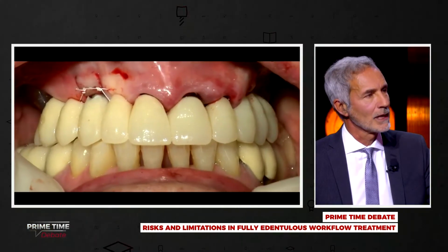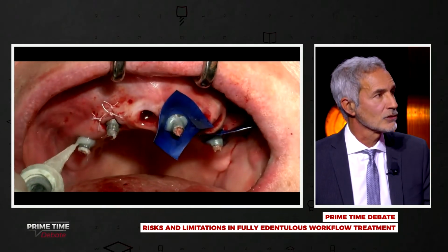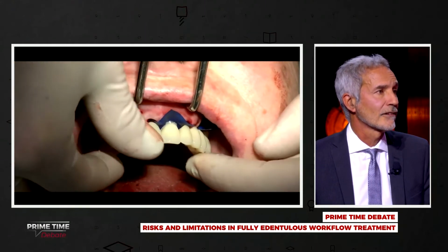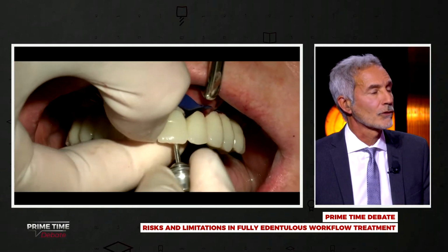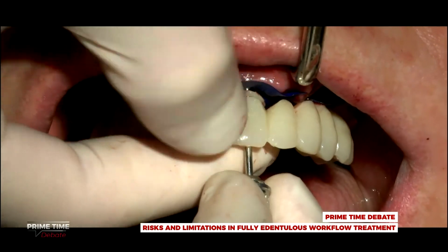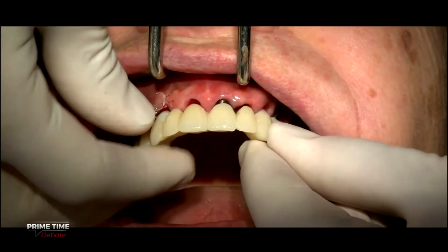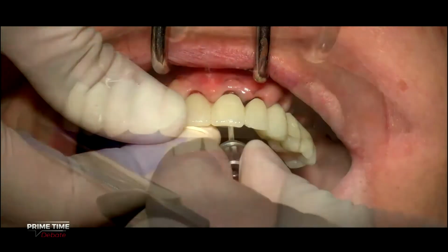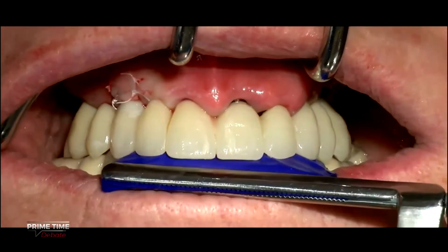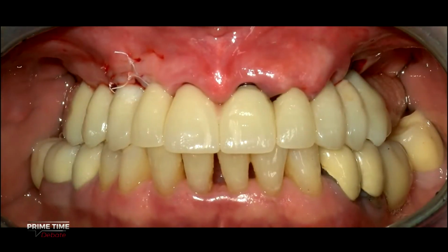After replacing the abutment and titanium coping, we fixed the procedure. You can see the precision of this procedure that needs a relining, but the reference point of the occlusion is very correct, and this is a very fast procedure. Before, when I went freehand, this procedure was very long and time-consuming. Now this phase is very fast and smooth. Few occlusal refinements. You can see the holes are in the very right position, and we can say that we obtain a very nice result.